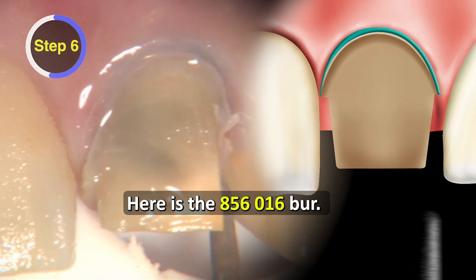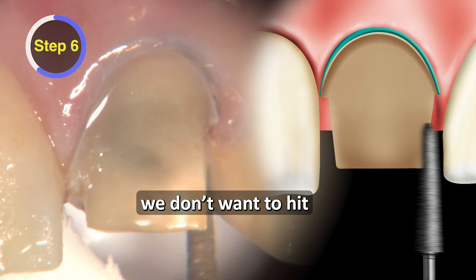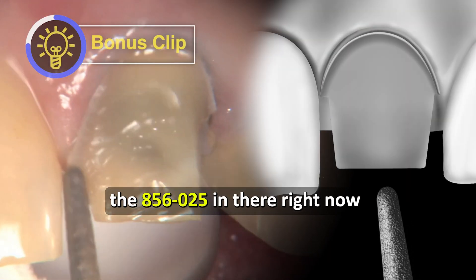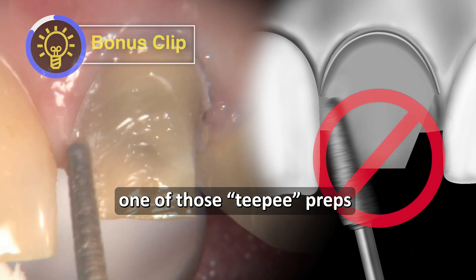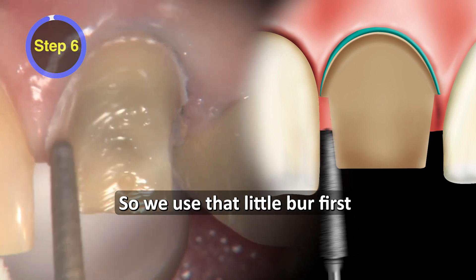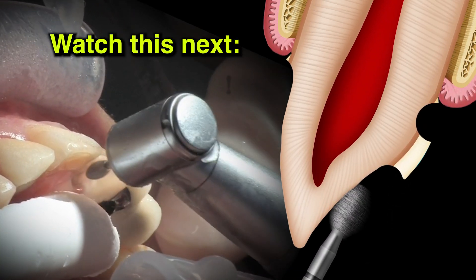Here's the 856016 — that's the little brother of that other one. We can hold that vertically and take it in between that tooth and the PFM next to it without hitting it. We can take that on the mesial aspect of tooth number nine and create that same kind of vertical wall down to the level of the gingiva without hitting tooth number eight next to it. If we took the 856025 in there right now, we'd have to tip it so far over that we'd end up with one of those TP preps — that's how those teeth tend to get over-prepped in the incisal third, by taking too large a bur in proximal too quickly. So we use the little one first, then finish up with the 856025, blending those depth cuts.